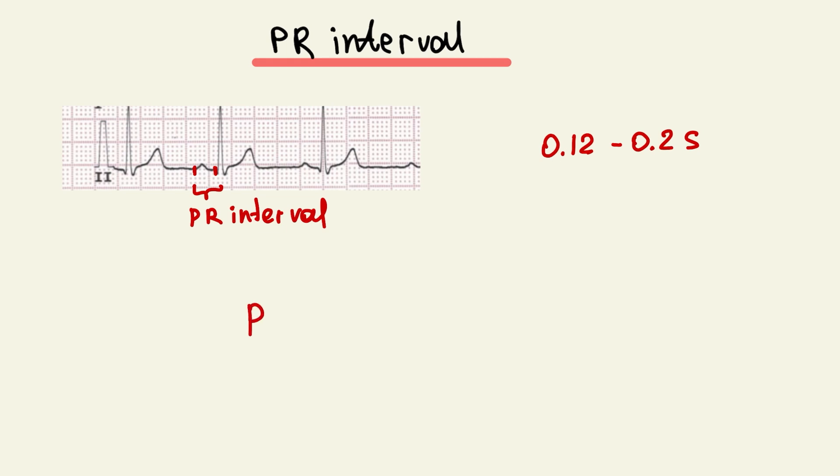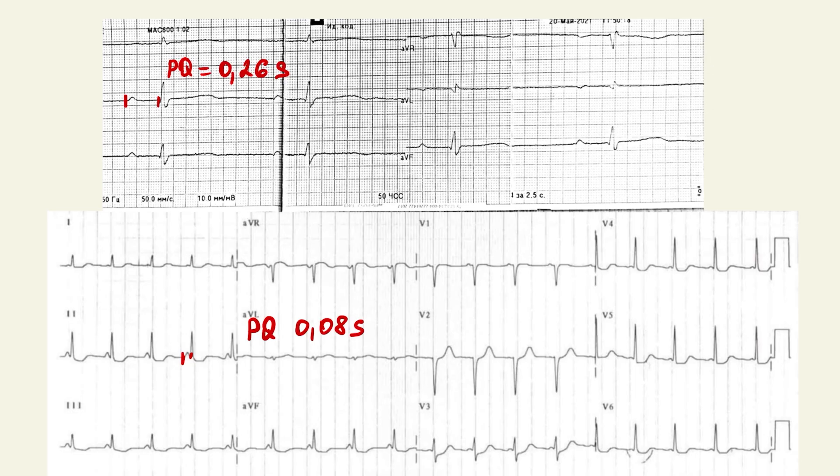If PR interval is less than 0.12 second, it's pre-excitation. If PR interval is greater than 0.2 seconds, it's AV block. Here you can see examples of first degree AV nodal block and pre-excitation.